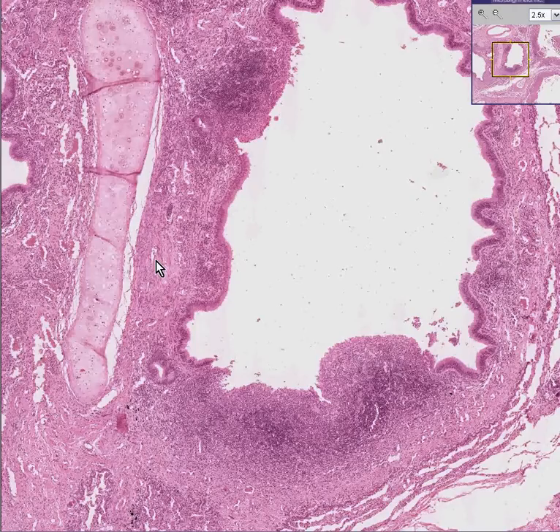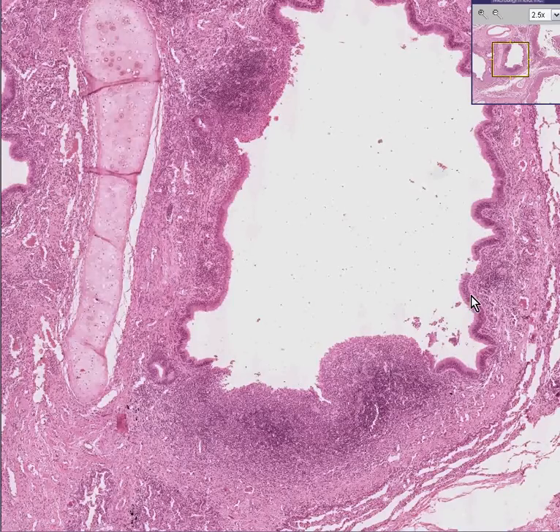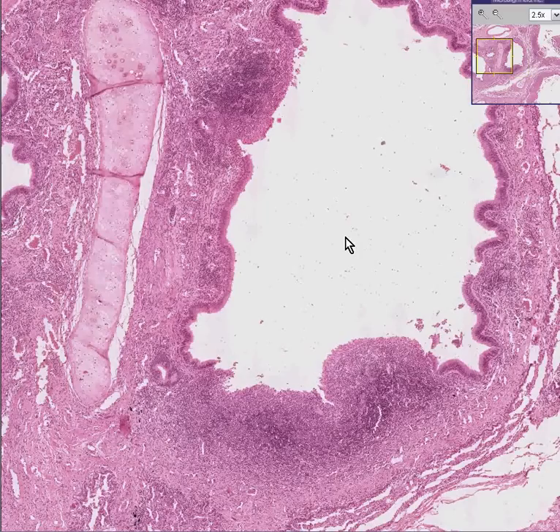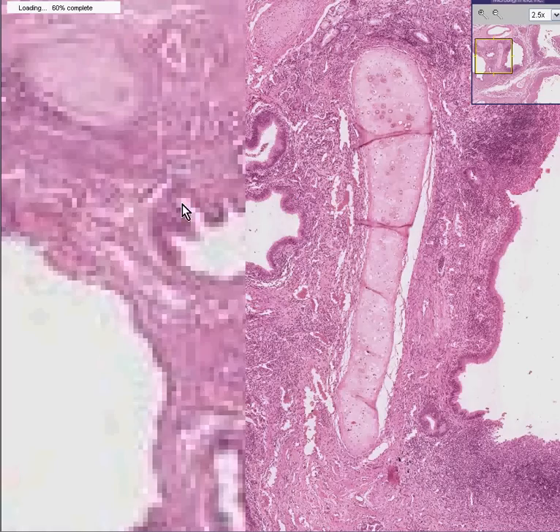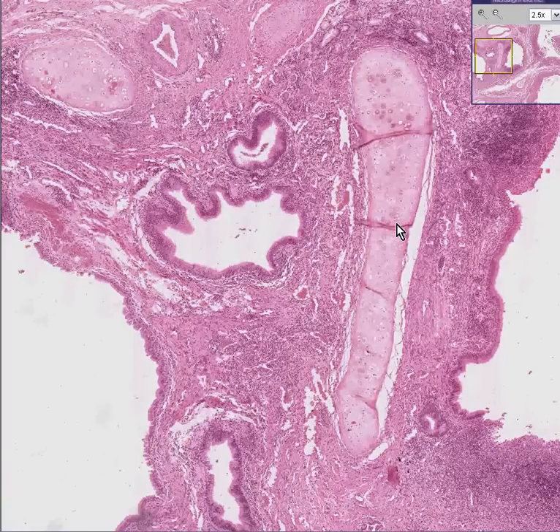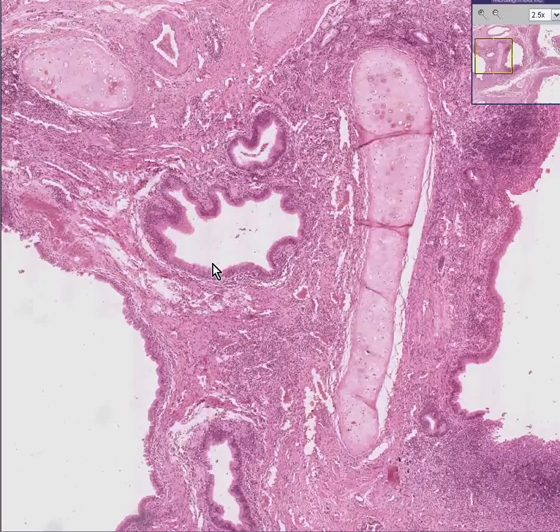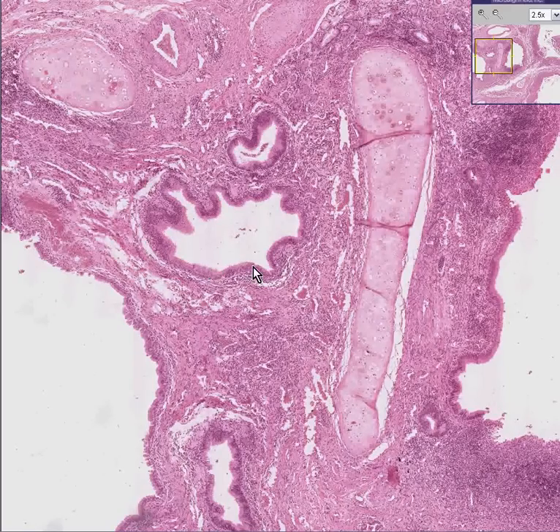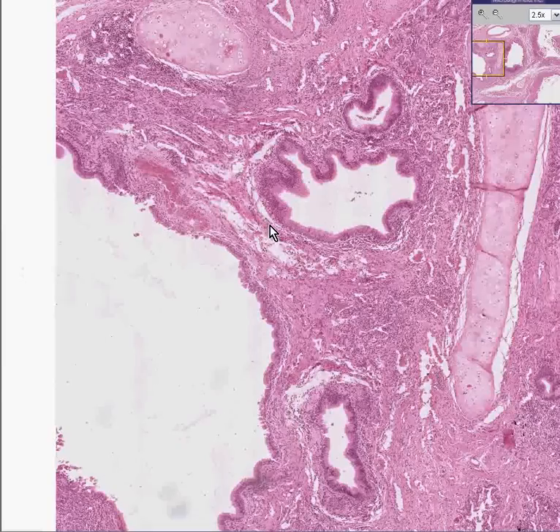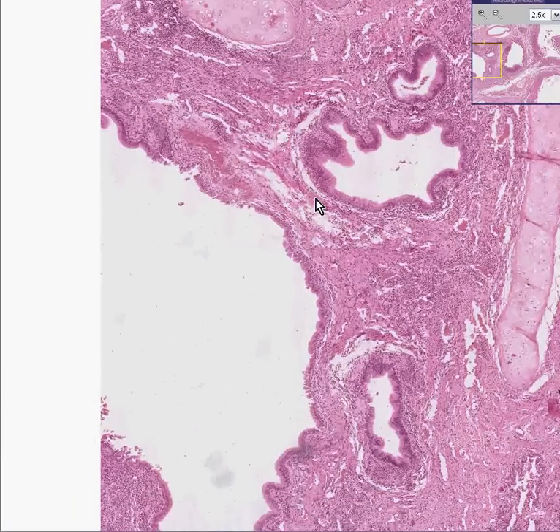You can see in here that perhaps 80 to 90% of the mucosa is intact. The other 10 to 20% down here in the south is ulcerated. You can see here is a bronchus or bronchiole — the difference being bronchi have cartilage around them, bronchioles don't. Sometimes it's hard to figure out; generally bronchioles are a lot smaller. This could be either. This one is 100% intact. But generally, the ones that are the largest are the ones that have the most inflammation for the reasons we mentioned.